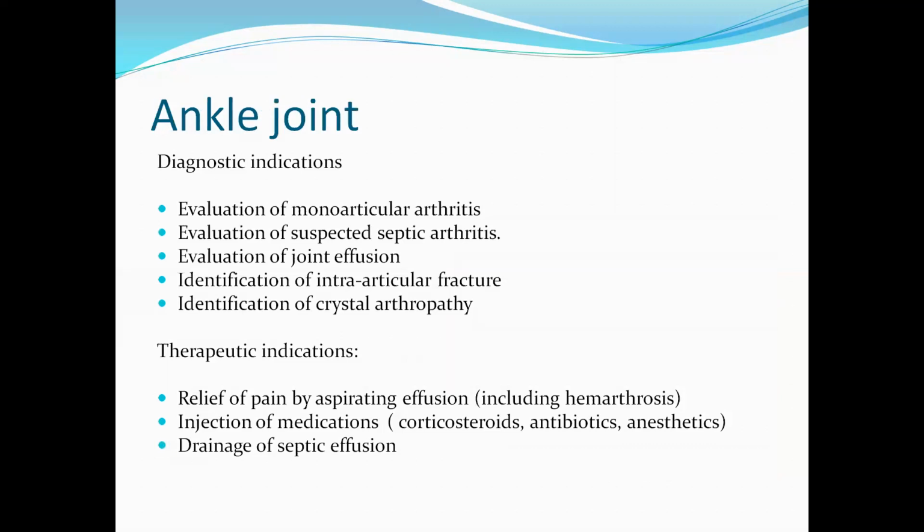Next, coming to the next joint, the ankle joint. Ankle joint injections are not so common because arthritis conditions are very common in other larger joints. But however, ankle joints sometimes require injection, like in post-traumatic arthritis conditions, rheumatoid arthritis, and other arthritic conditions.